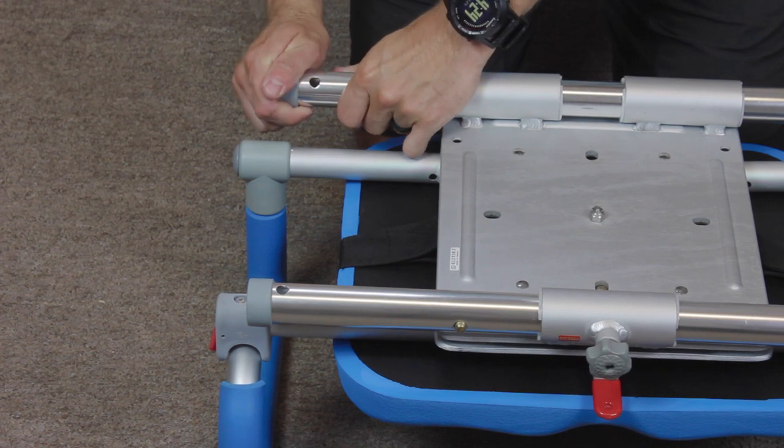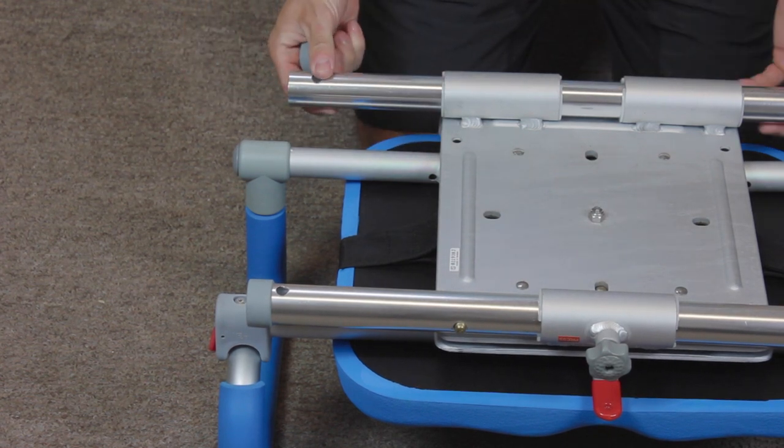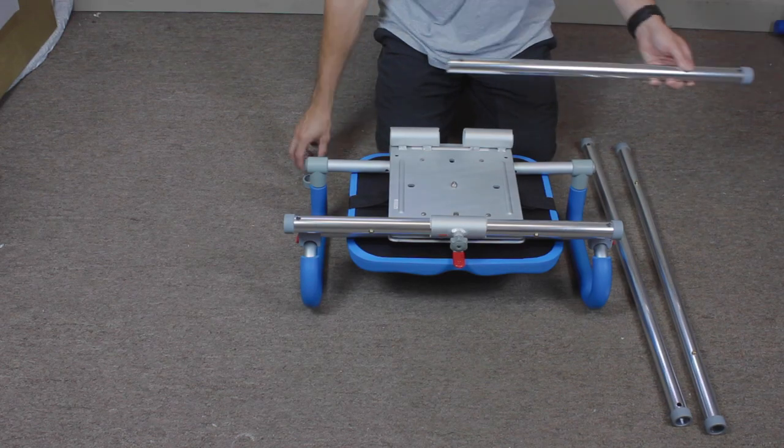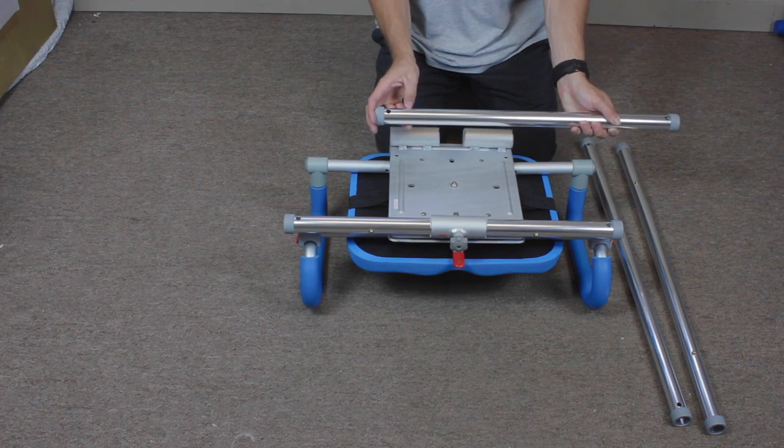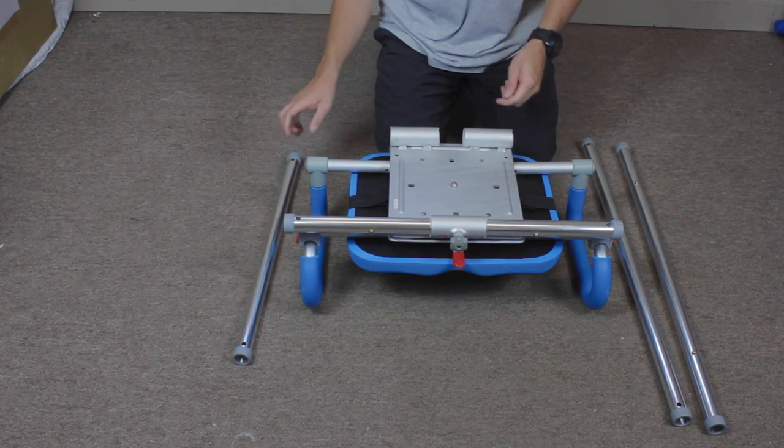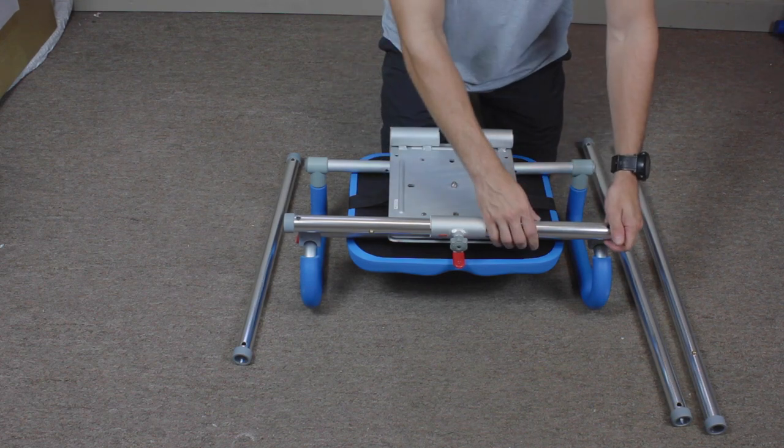If you're going to remove the standard rails, take the end cap off one side of the rail and then pull it through the base of the chair. Replace the end cap and set the rail aside. You'll want to do this for the front and back of the chair.